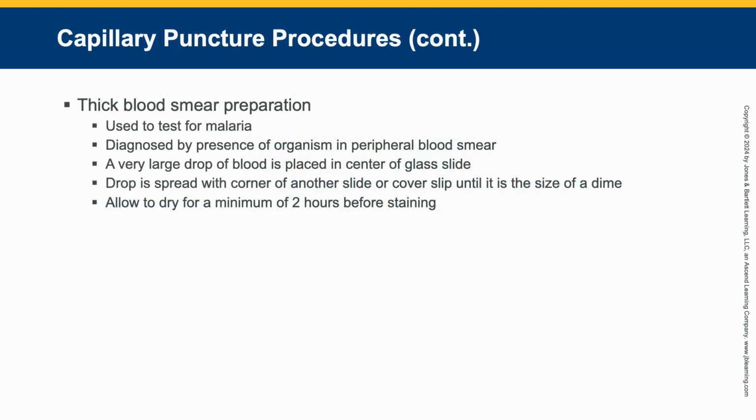Okay, that was a thin blood smear. Let's talk about the difference. A thick blood smear. These are most often requested. You need to know test-wise, why do they ask for a thick one?